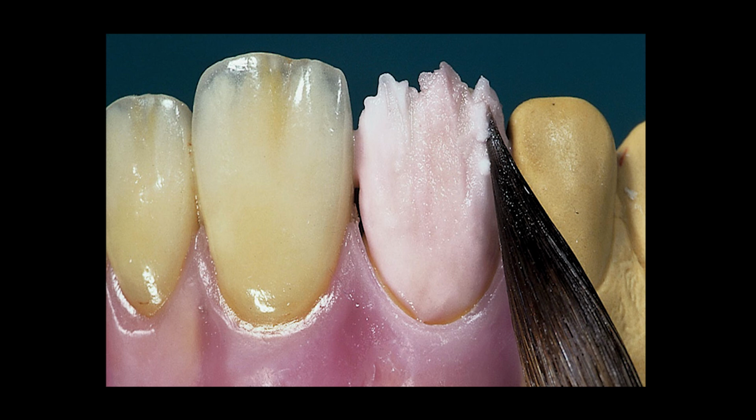It might be a little extreme, but the moral of the story is if you give us a detailed photo and we see those subtle nuances in natural teeth, it gives us the ability of building that in because we can hand layer each individual bit of porcelain to make that effect. So I hope that truly helps an understanding of what you can provide the laboratory and the detail that we can actually really help you be more successful in your practice.